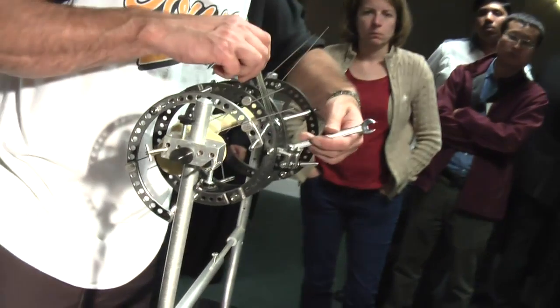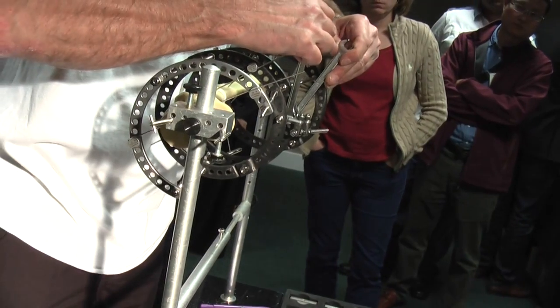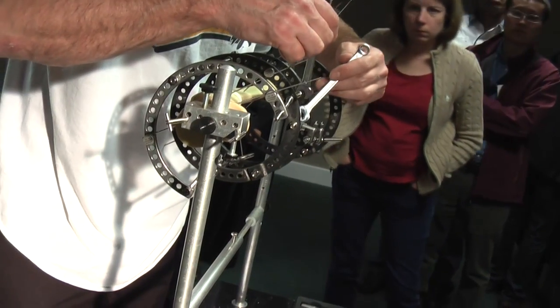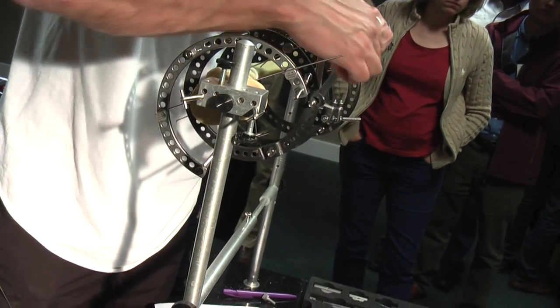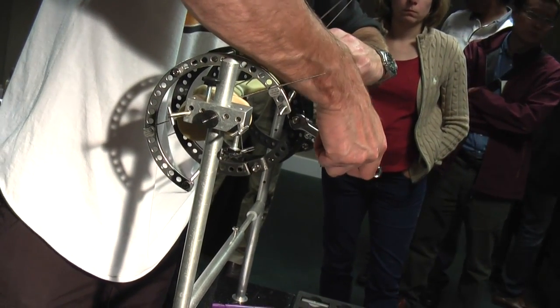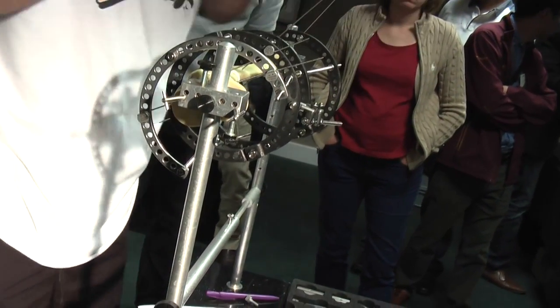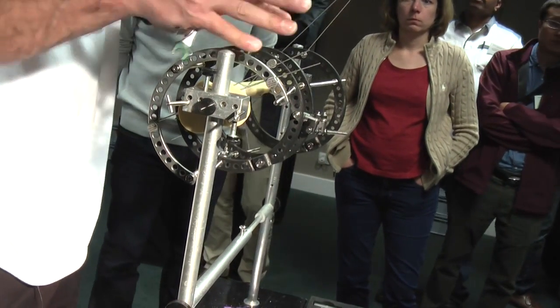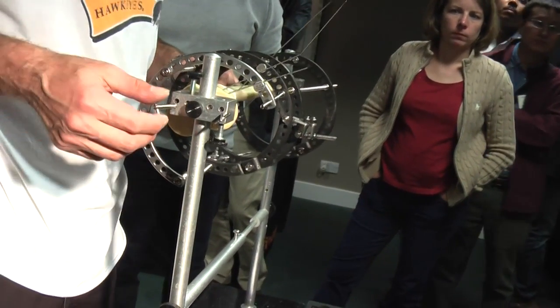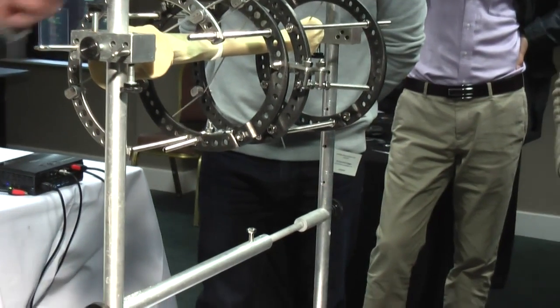So if you think about it, we have to all intents and purposes build a three-legged stool, one leg of which is adjustable. And three-legged stools don't wobble, but they do slope. Okay. Now obviously, when you're doing this for real, you'd put some more wires in or some half pins or whatever you're going to do. But that basically is the frame done, which means that scientifically, if we cut this bone and pull, it should all just go straight, shouldn't it?